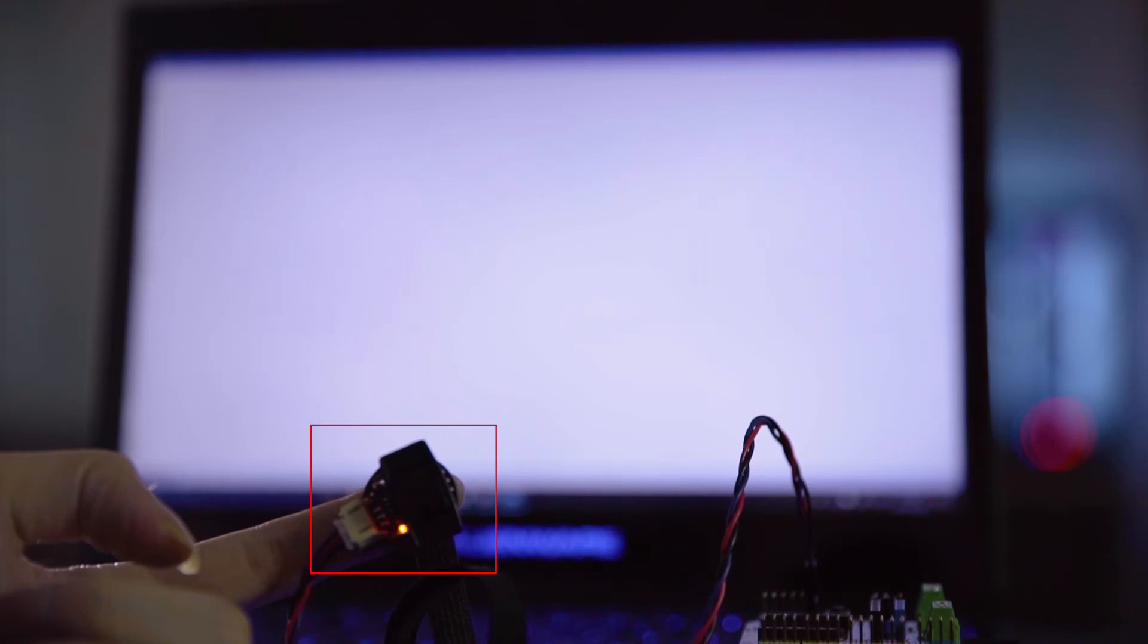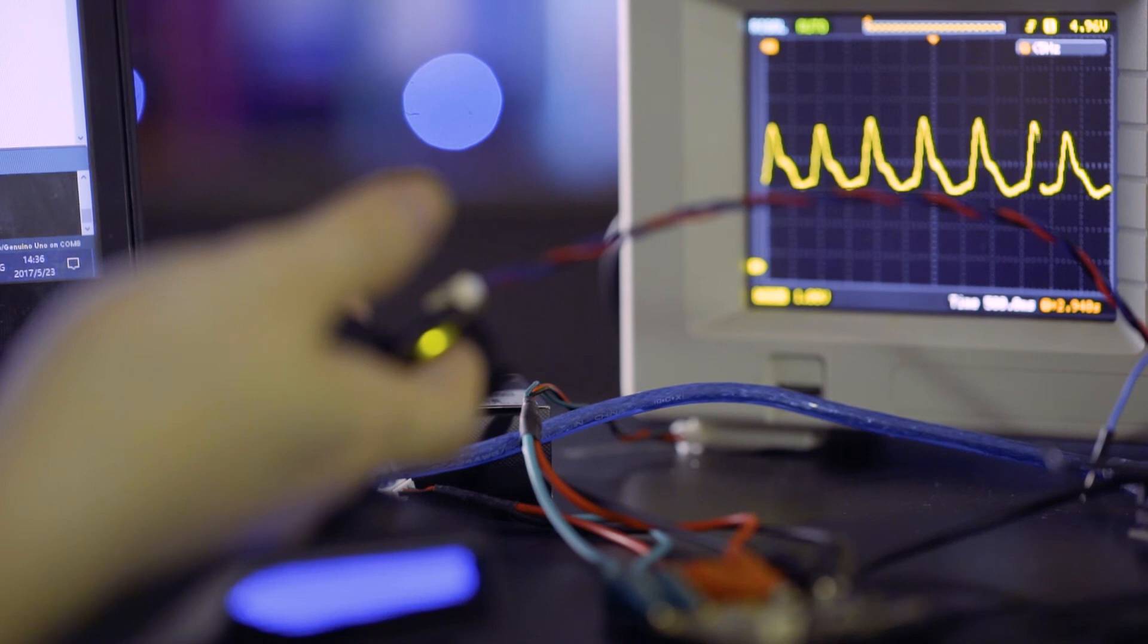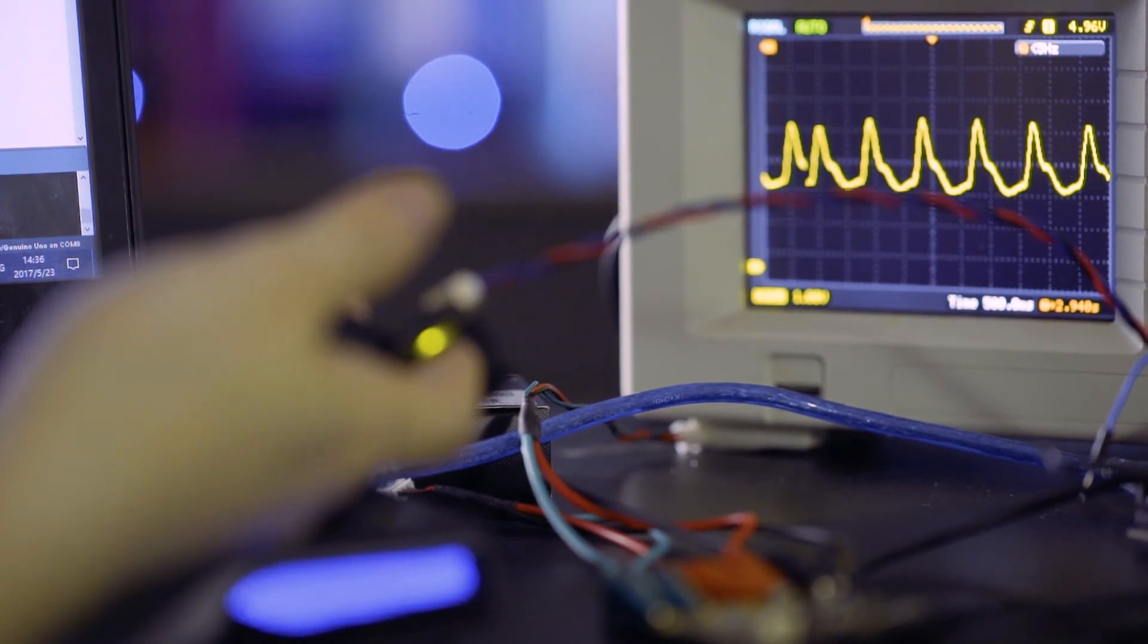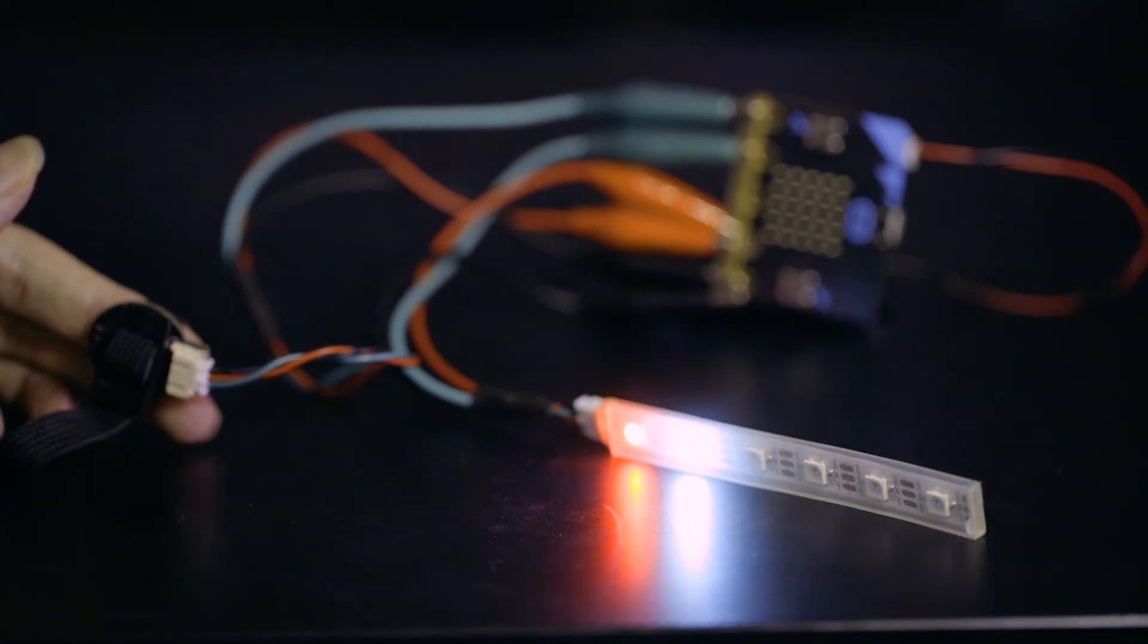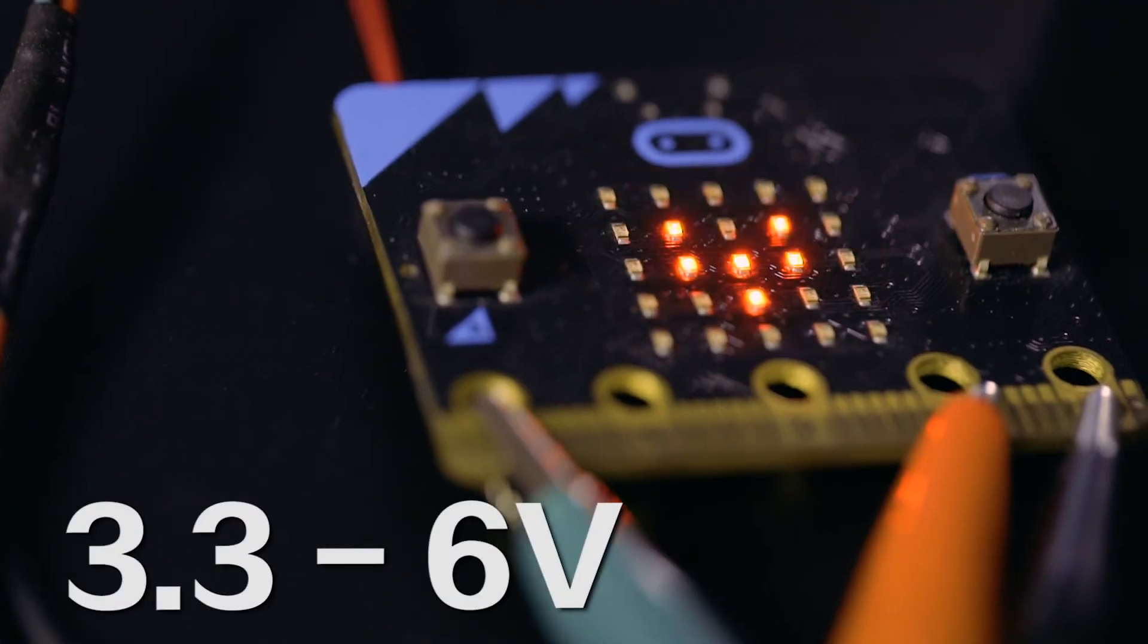Meanwhile, the onboard LED also blinks at the pace of the heartbeat. We can also read the value from devices such as an oscilloscope, but we have to make sure the power supply doesn't exceed its 3.3 to 6 volt rated voltage.